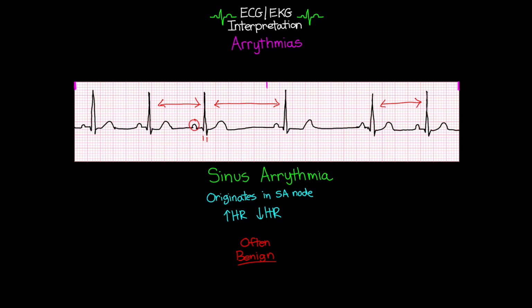But certainly once you master identifying these basic arrhythmias, definitely look into some of these different things that are out there, because once you've been out there and you're on the floor and you're looking at these rhythms that your patients have, a lot of times you're going to come across things that you just don't quite know what it is, and you have to often think through it or grab a friend and talk over what's going on and try to figure out what's happening.